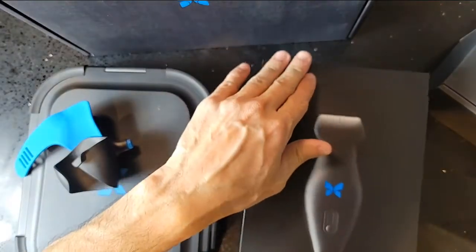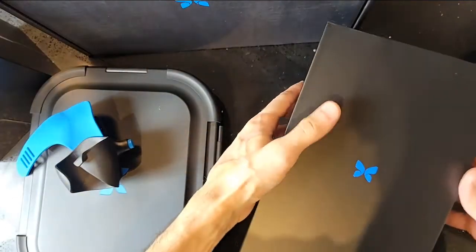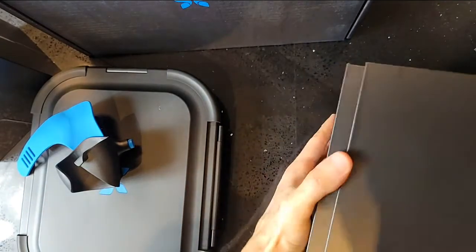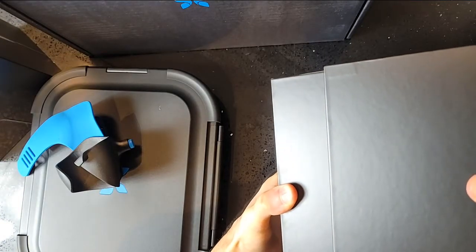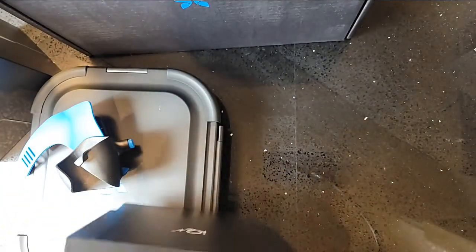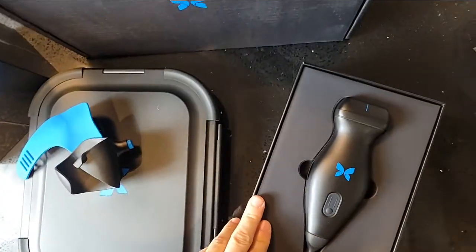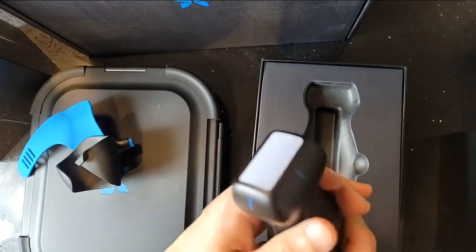Let's move on to the probe — this is literally the first time I'm opening it up, so you're seeing it in real time with me. Sliding the outer case off, opening it up — a lot of air pressure, nice and tight. That's a well-designed shipping case, making sure the product isn't damaged in transit. Kudos to Butterfly for that. The probe is out on the sheets for the first time — it's nice and cold.